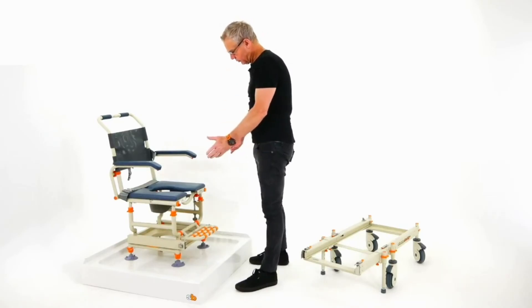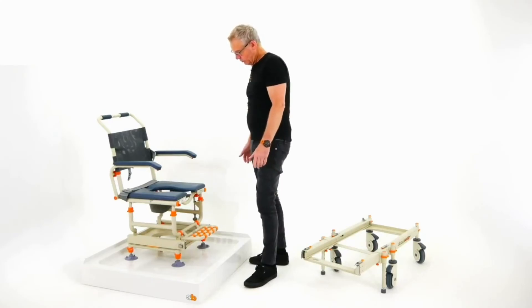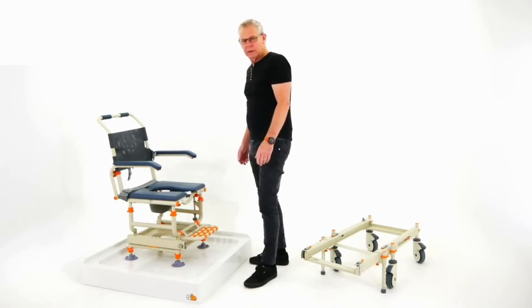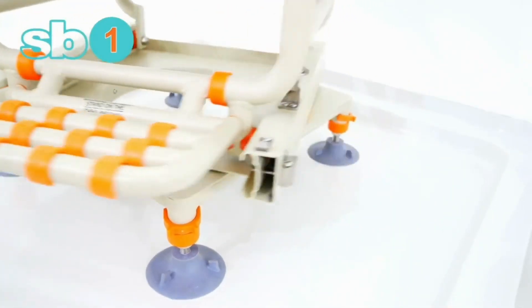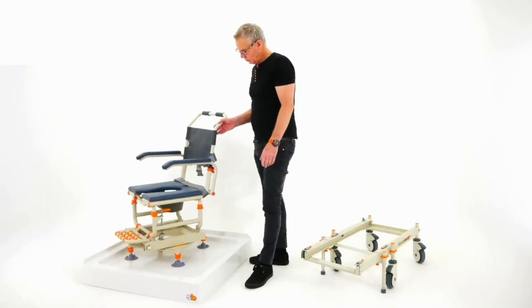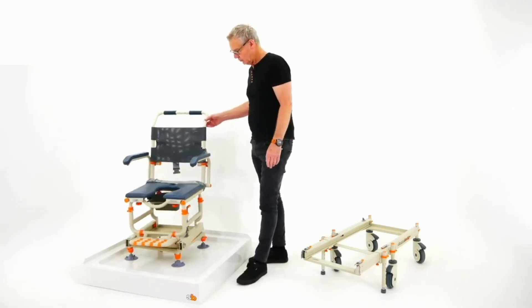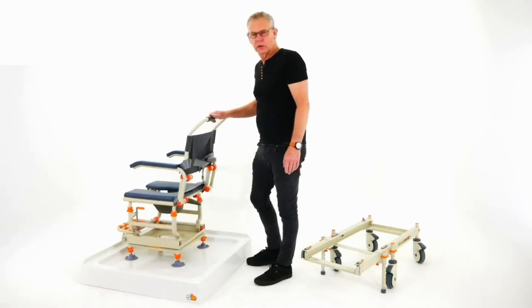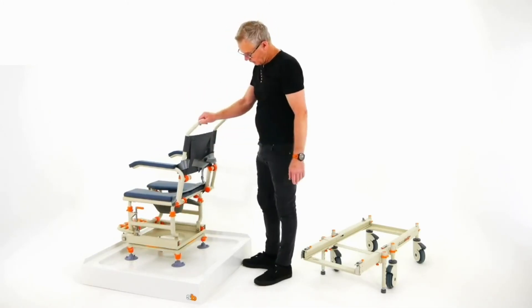What a fantastic option — suddenly your user is able to have a private shower with some dignity. Another feature of the ShowerBuddy is its rotation, which is very easy to use. Should the water be positioned here, your user can have the water on them, or a carer can attend to hair washing or the back of the client.